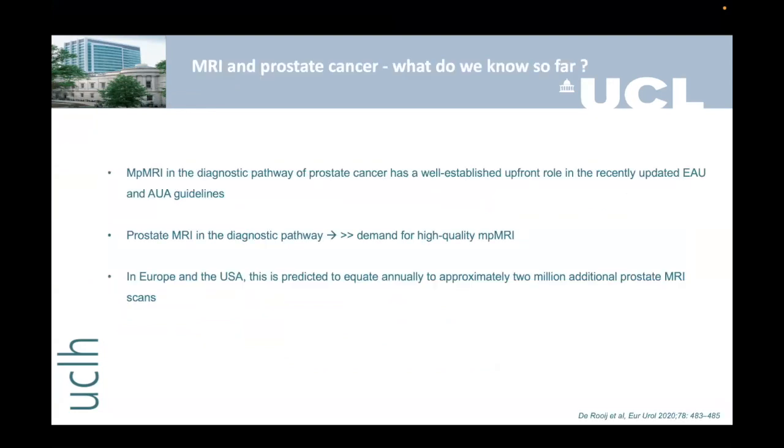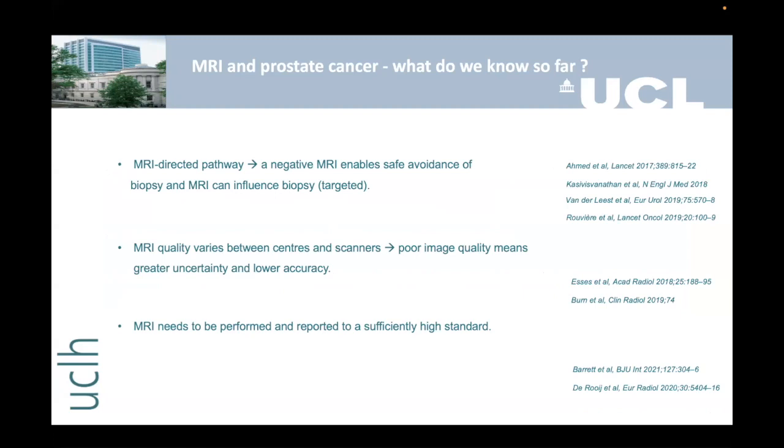So we know the importance of prostate MRI in the diagnostic pathway, and now MRI is recognized as a very important tool, both in Europe, in America, Canada, and Australia as well. We also know that there will be a huge demand for prostate MR scans in the next years. And you also know all these publications that are cited here in terms of the role of MRI in the pathway for diagnosing prostate cancer.